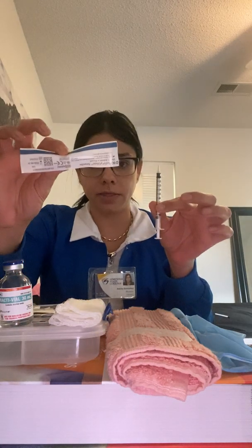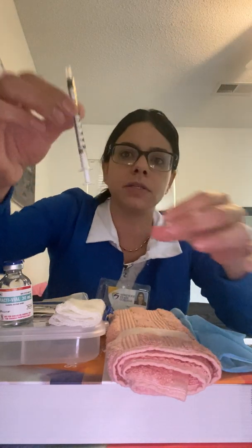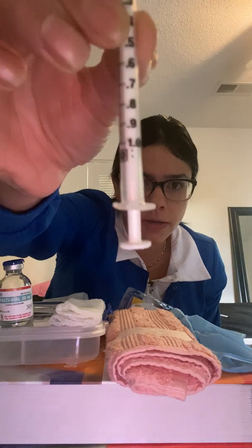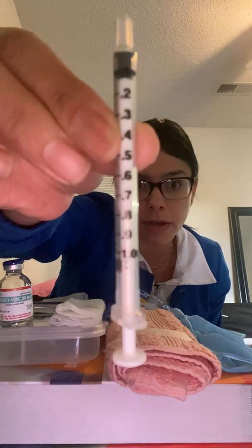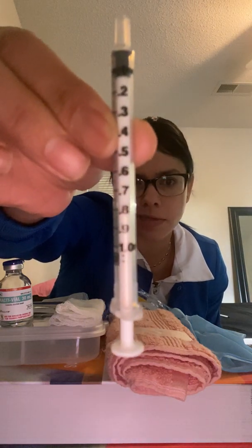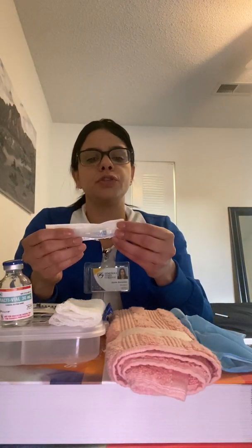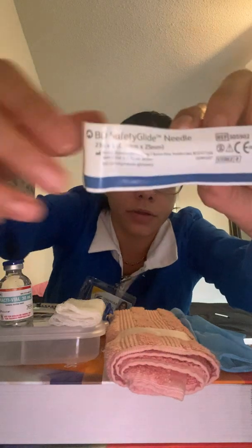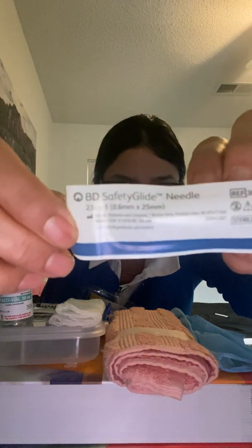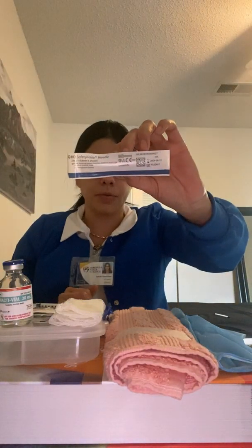And of course I have the syringe and the needle. Because it's 0.5 ml, I'm going to be using a 1 ml syringe. Hopefully you can see it. It's this 1 ml, and the numbers are very clear because I'm going to be getting only 0.5, so it's easy to draw. And the needle that I'm going to be using is the 1 inch, 23 gauge for a deltoid intramuscular injection. You can use a 1 inch from 21 to 23, and as you can see it right there. So this is the one that we are going to be using.